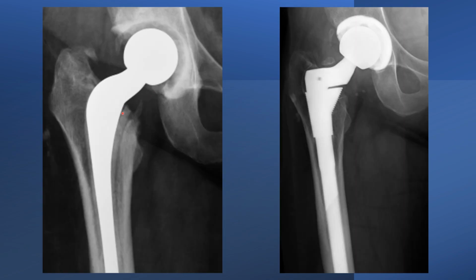The type of replacement we use will be a function of the amount of bone that's remaining. This patient, you can see, has a spacer here, but there's still a substantial amount of normal bone. And in this, we'll often use a proximal fitting stem or proximal filling stem with distal fixation. So it's a slightly different type of design because this patient has much more of her native anatomy remaining. This is an 11-year follow-up. So we can see with a 2-stage exchange, the studies show that there can be a 90% probability of success in treating infection over the long term.